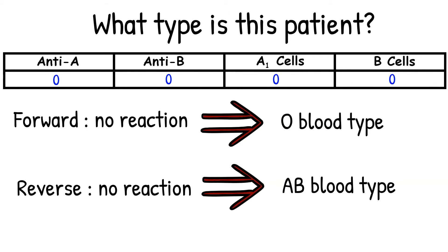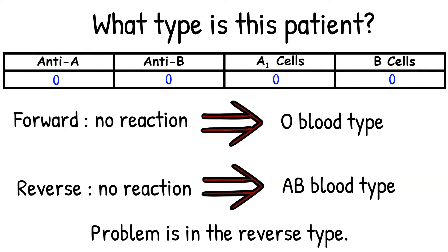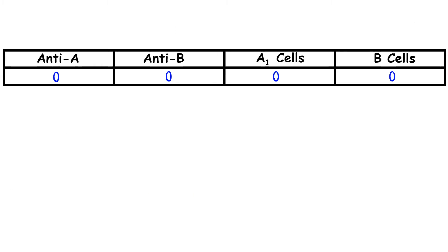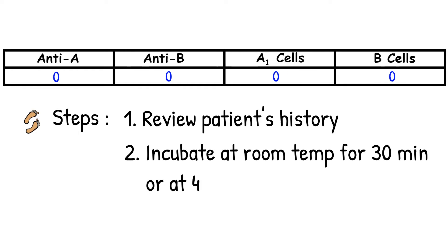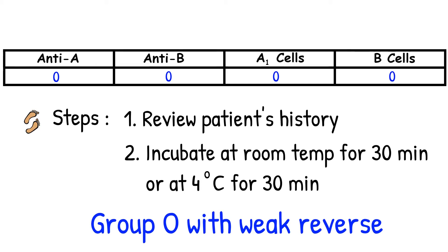The red blood cell reagents are usually reacting really strongly. So my first thought is missing reactions in the reverse typing. This means that the patient is potentially type O but missing anti-A and anti-B in the patient's plasma. I will assume that I did everything correctly and get the same reactivity when I repeat. First, check the age of the patient and the patient diagnosis. Second, incubate the test at room temperature for 30 minutes or at 4 degrees Celsius for 30 minutes, or you can do both. Third, read the reaction again. If the reverse comes up, you can confirm that the patient is group O with weak expressions in the reverse typing.